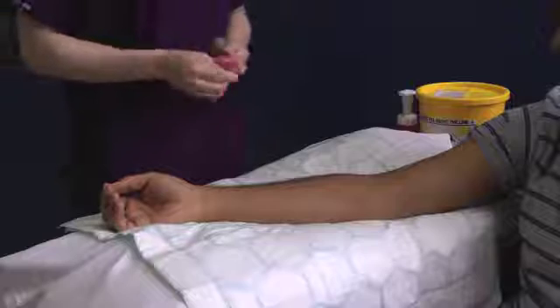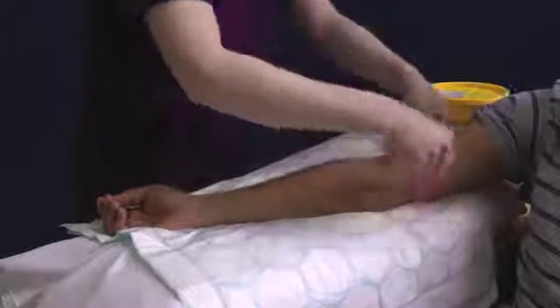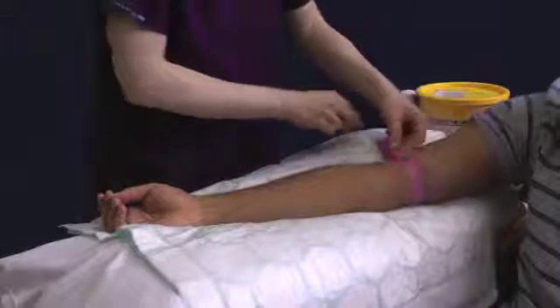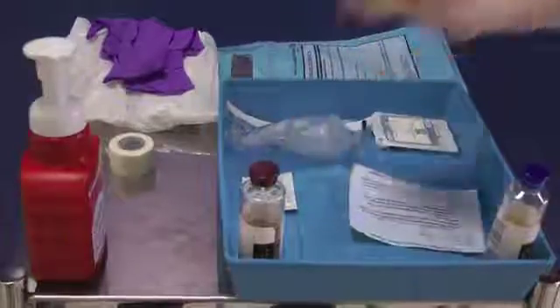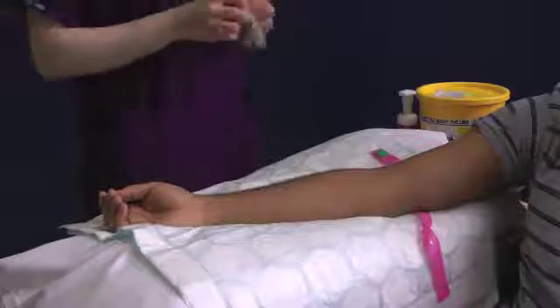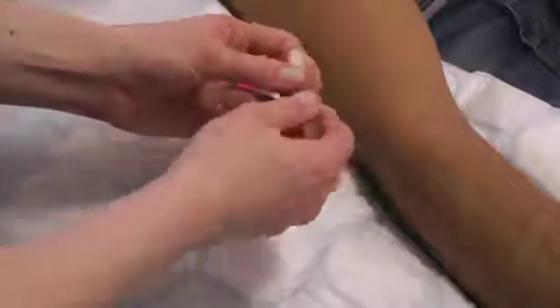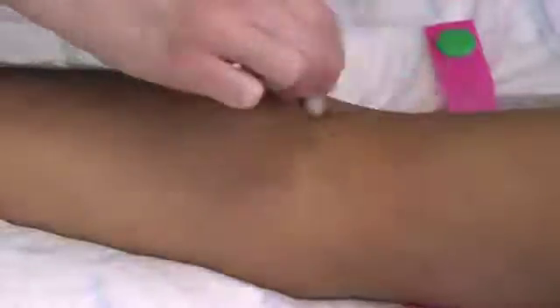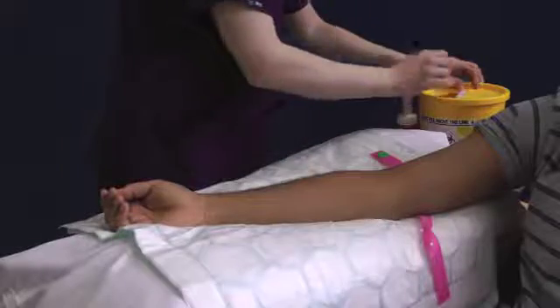Apply a disposable tourniquet to the patient's arm and palpate for a suitable vein. Once you have located the vein, release the tourniquet. Remove the ChloraPrep applicator from its packaging and squeeze until the inner tube breaks. This releases the ChloraPrep solution. Clean the proposed puncture site in a hash formation and allow to air dry for 30 seconds. Dispose of the ChloraPrep into your Sharpspin.